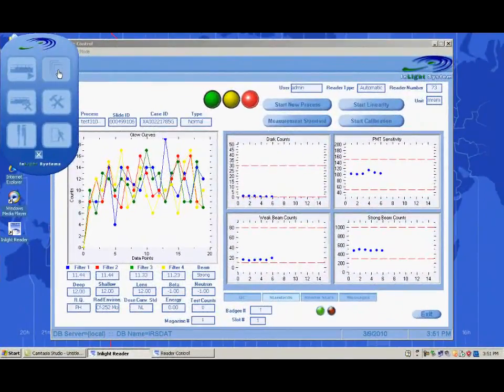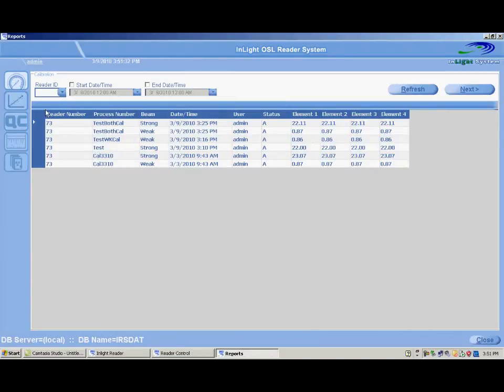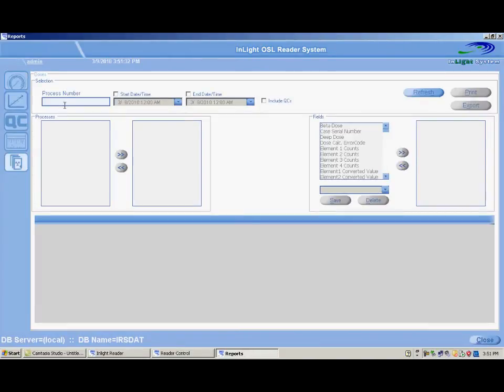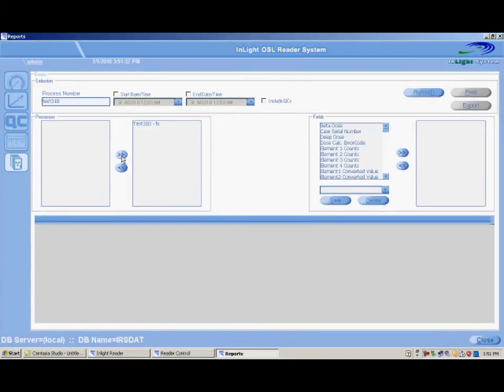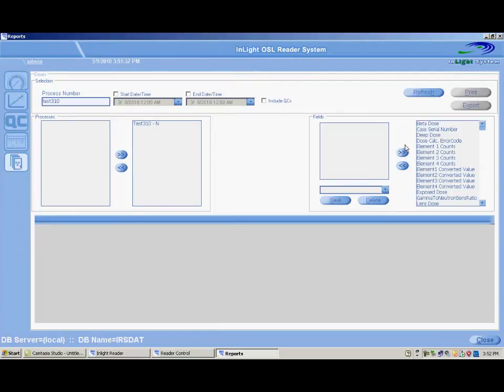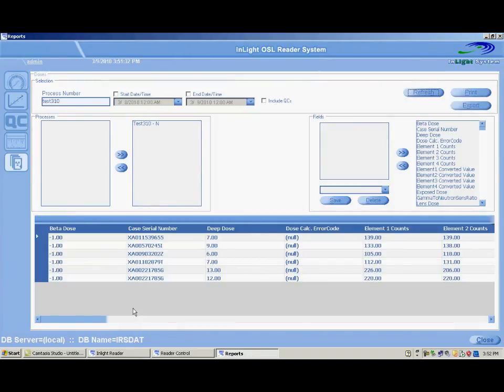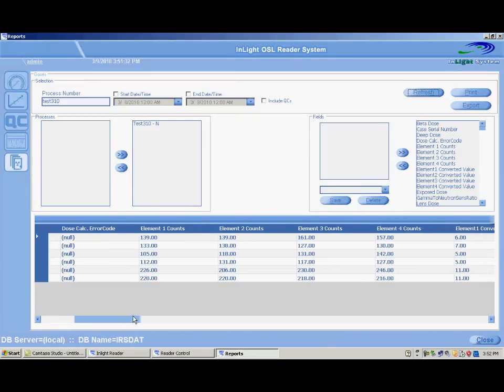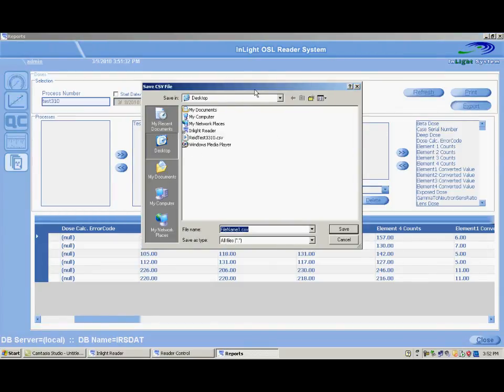You can view and export the dose data by clicking the Reports button on the menu screen and selecting Dose Reports. You can either type the name of the process you wish to view or choose a date range and select the report from the list. Click the Refresh button to see the report names. Select the report and then click the Move button to move the report to the selection area. Multiple reports can be chosen and added to the selection area. Select the fields to be displayed by highlighting and then clicking the Move button; multiple fields can be selected using the Shift or Control keys. Click the Refresh button to generate the report. The report can be exported to a CSV file by clicking the Export button, then choosing the location to save the report.